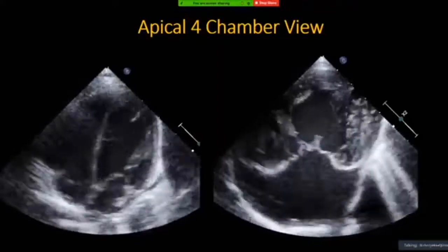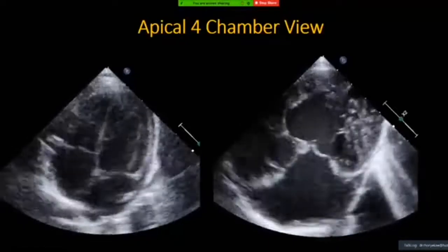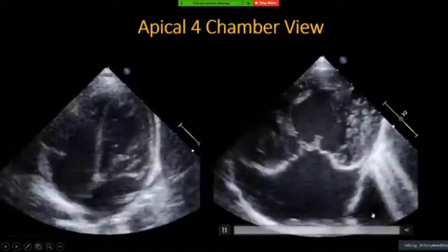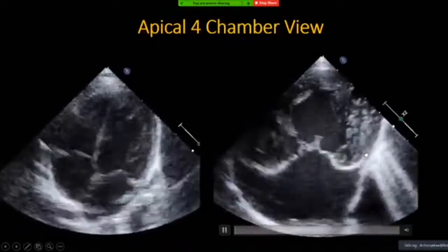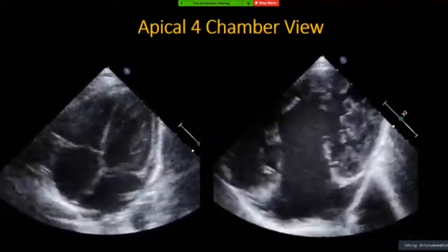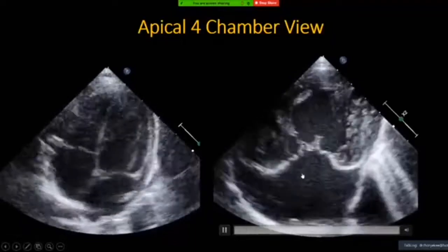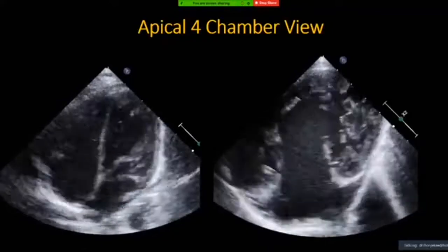So remember, this is basically not to teach you to get the diagnosis. The main thing is that we identify what is normal, and when you see something abnormal, we know that the desaturation is mainly due to a heart problem. Our concentration is to identify the actual issue in the patient with desaturation. When you do ultrasound of the heart, this is what we see. It suggests that this is maybe a heart problem, hence we need to refer to a cardiologist for further evaluation.